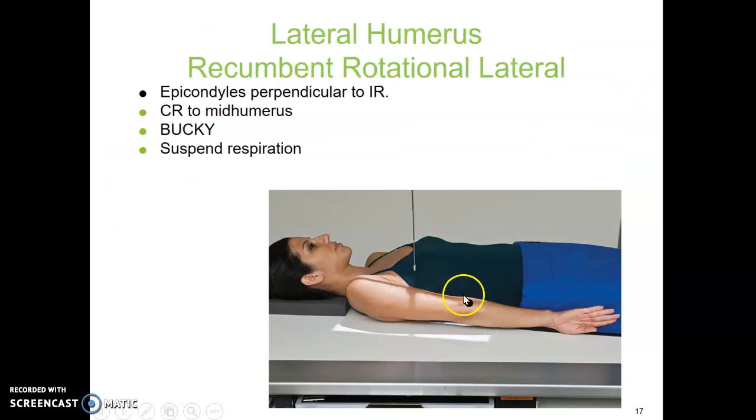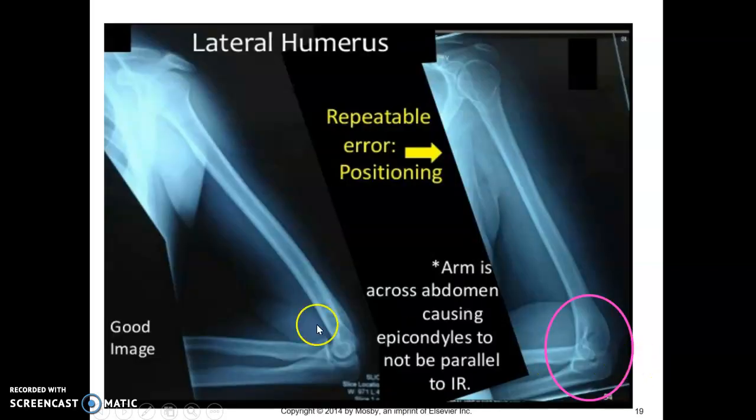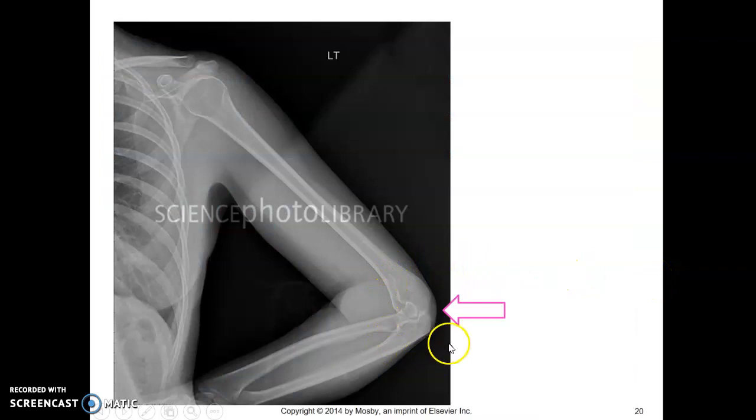If they need to be lateral, it's the same position — internal rotation, get those epicondyles perpendicular to the IR. On this one, you're going to see the lesser tubercle in profile, and the epicondyles should be superimposed. This should look like your lateral elbow image. For repeatable errors: a good image has superimposed epicondyles and an open elbow joint space. A poor image has the epicondyles not superimposed — the patient most likely had their hand across their stomach — and you would need to repeat to obtain a true lateral.